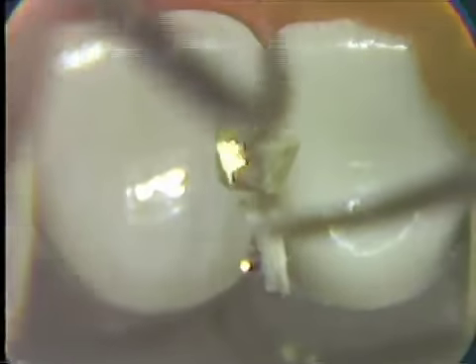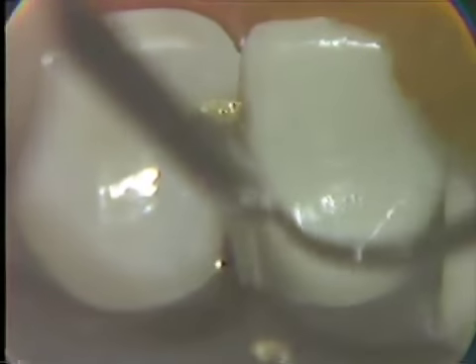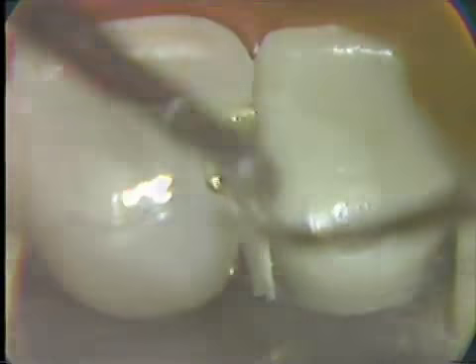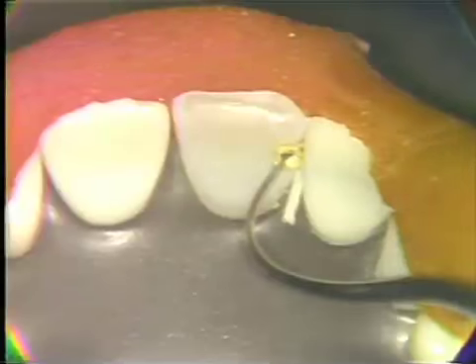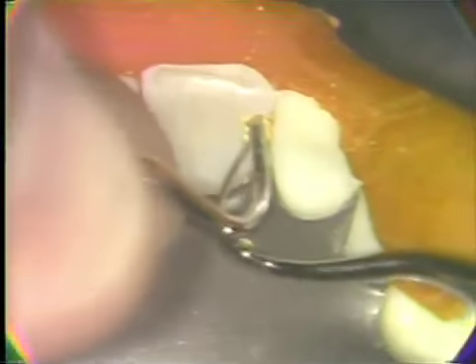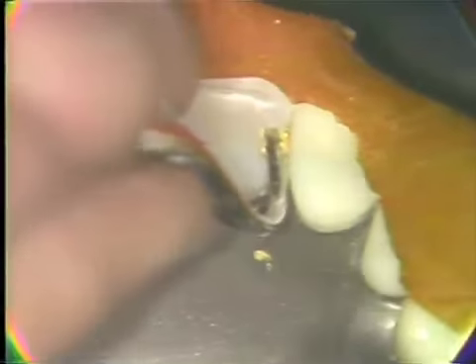Utilizing the larger aspect of the condensing instrument first to lay this into position and then holding at the cervical area, condensing and directing that condenser now into the incisal aspect to lock that material into that retentive area.